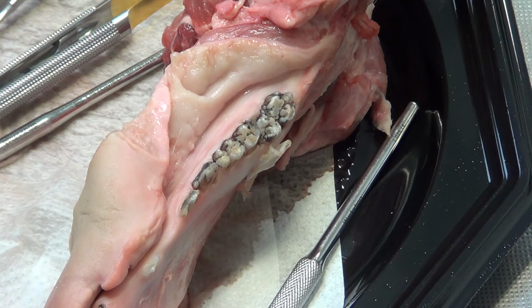Because otherwise, in the mouth, you do the incision and you know how much keratinized tissue we need from the palate. Okay. So if you have, for example, a distal area from the second premolar, we need 15 millimeters. We go to the palate, 15 millimeters of the graft, then we go down 15 millimeters of the incision. Okay.